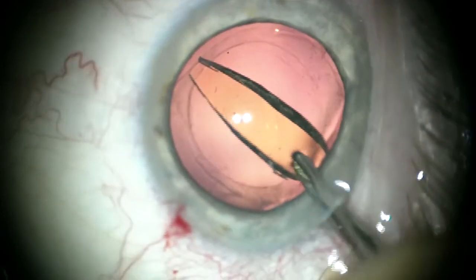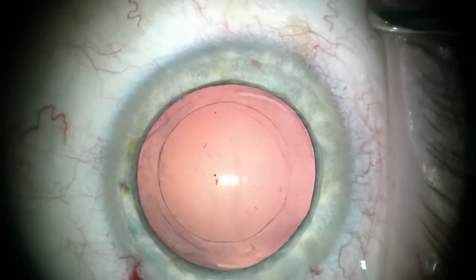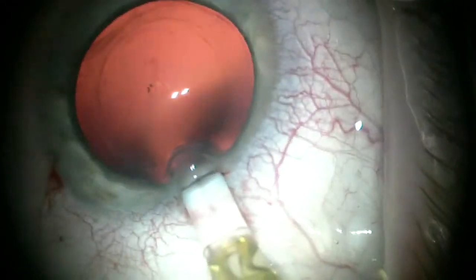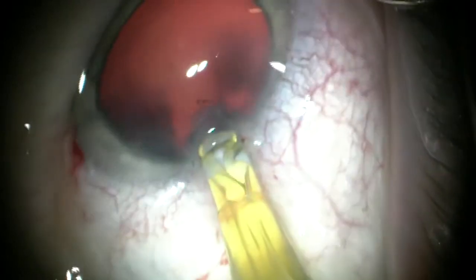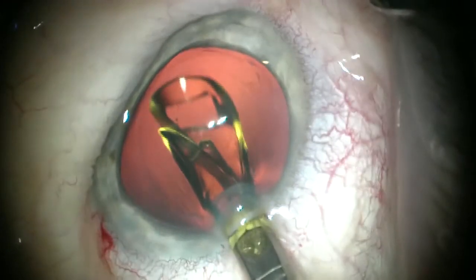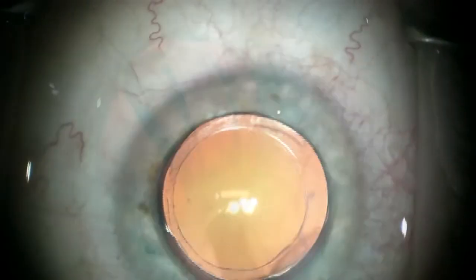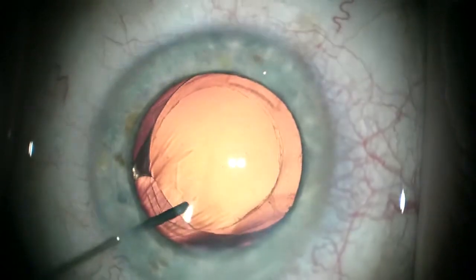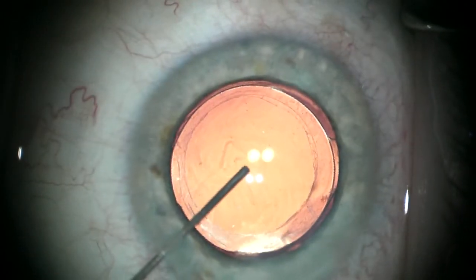I don't like to pull both out at the same time, so I'll take the scissors out first and then just grasp the remaining part with a non-toothed forcep. We can add more OVD if needed to put the new lens in the bag again. This technique has worked very well with the instruments that I have on hand.